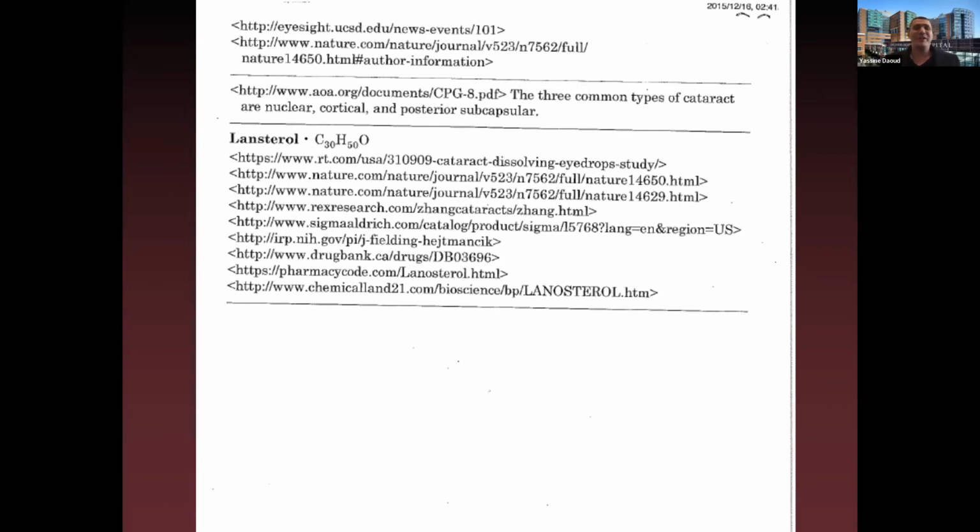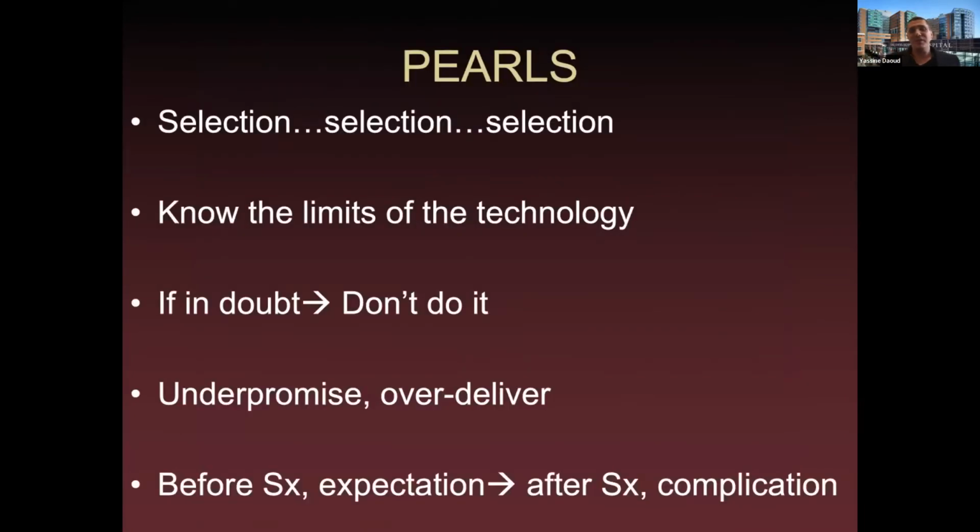So patients with type A personality, like the guy on Thursday, and the funny thing is that his wife said, wait, you're not type A personality. I am type A personality, the wife was telling the husband. I was like, well, neither of you is a good candidate for these lenses. He's like, well... I'm like, look, even if you pay me $100,000, please save your money. I cannot guarantee for you. But I think it's a great technology. So counseling the patient is really important.